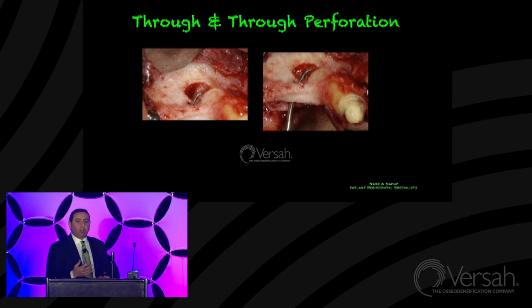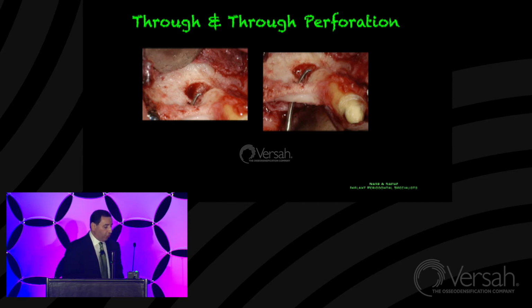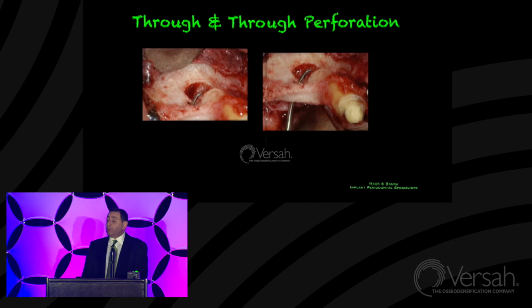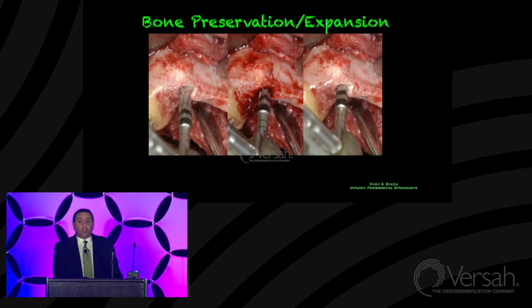However, the patient said, you know what, I've had this temporary bridge forever. I'd like you to at least give me an opportunity. Maybe if you can just place one implant and then I can have something there, because this temporary bridge is a problem. The patient happens to be a musician that has concerts all over the world. So imagine trying to play your instrument, and he uses a wind instrument, with this type of restoration in your mouth.